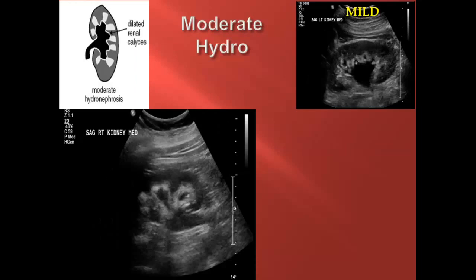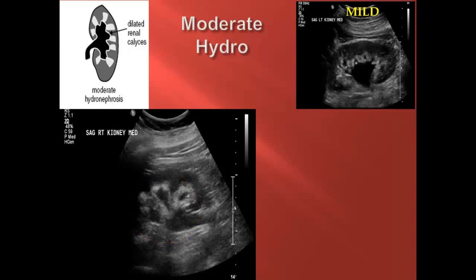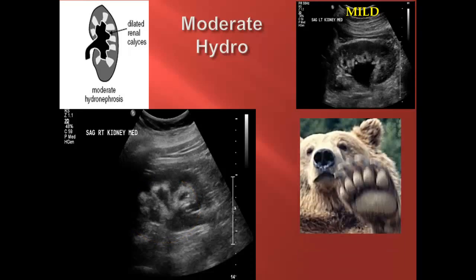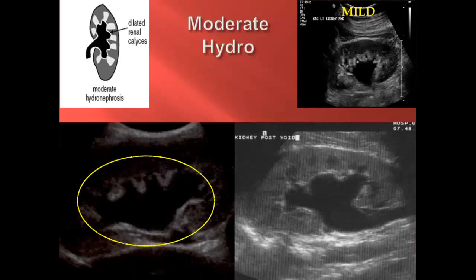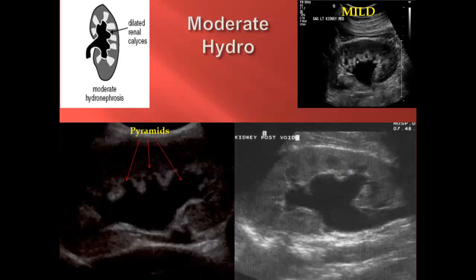Here we have an example of moderate hydronephrosis in the bottom left corner and a case of prominent mild hydro for comparison in the upper right corner. In moderate hydro, progressive dilation of the calyces leads to glove-like splaying of the sinus and ballooning out of the medullary pyramids. This appearance has been compared to that of a bear claw. Here we have two examples of moderate hydronephrosis, and you can notice the glove-like splaying of the sinus and ballooning out of the medullary pyramids creating the appearance of a bear claw.